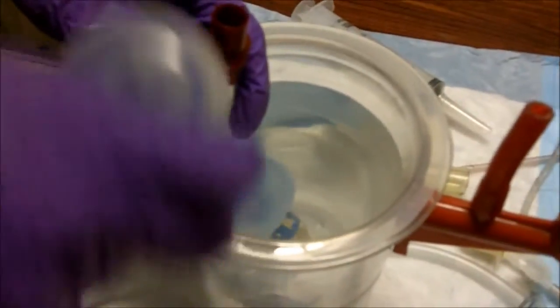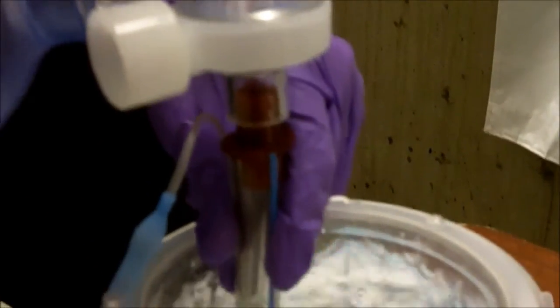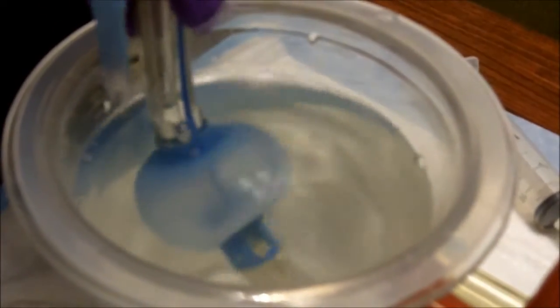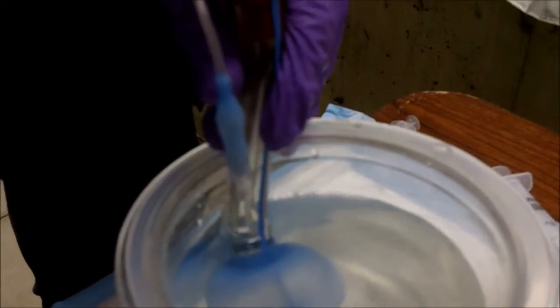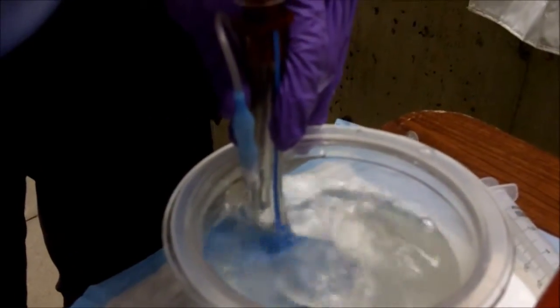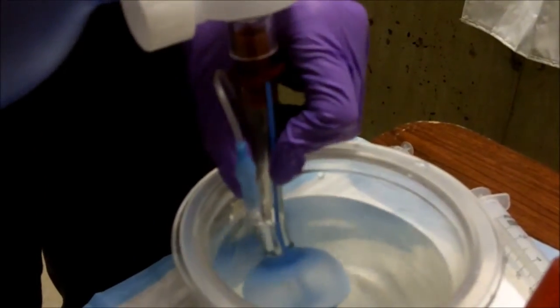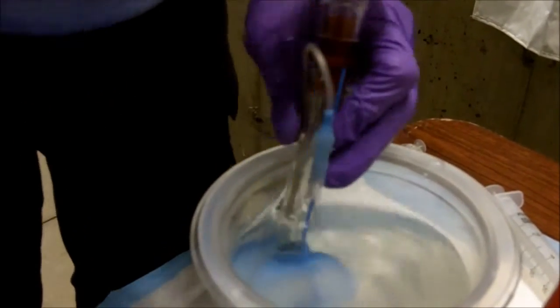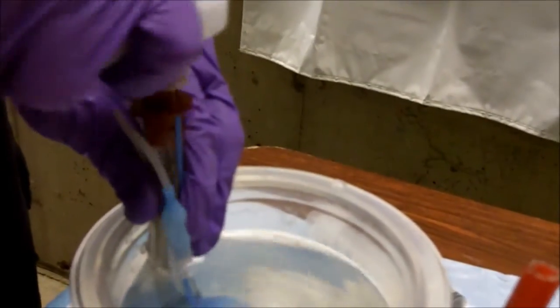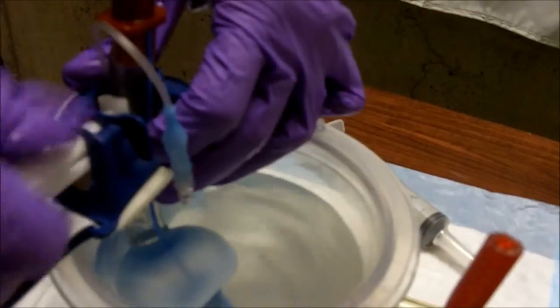Now we're in place. We take the cap off the BVM. An essential part, and this is now we're at step five. While bagging, we're going to withdraw on the tube so that when auscultating the chest, we hear the best possible lung sounds from the patient. It seems a little incongruous to have bubbles blowing at this time. However, when you've drawn back, you will note at the markings of the King airway, and there's three levels here at what level you're at. We're at 14 centimeters now. And we will then secure the tube. Mind you, chest compressions will be occurring all the time while this is going on. We'll simulate the securing of our tube using a commercially approved device.